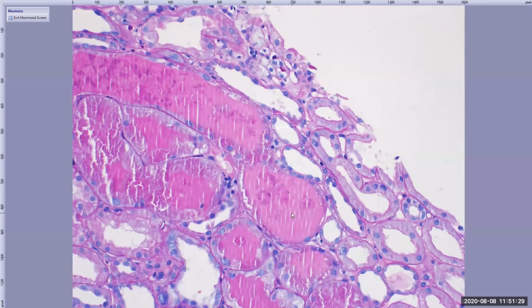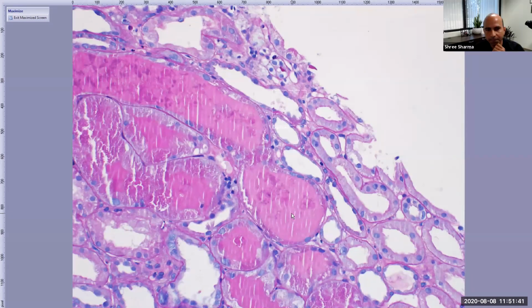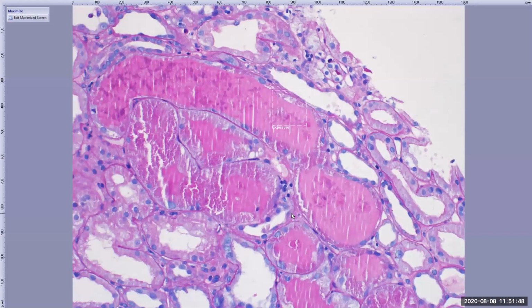Do you have a myeloma cast in your collection next to you? I don't have a myeloma cast nephropathy slide right now. I mean, as a non-pathologist, I'm thinking myeloma from that. And look at the far left-hand side, it looks like there's a really good crack there.